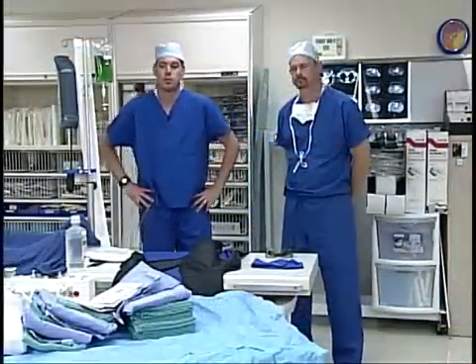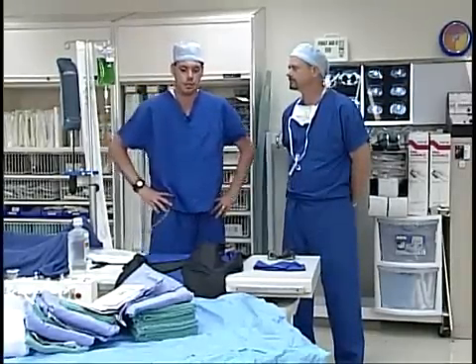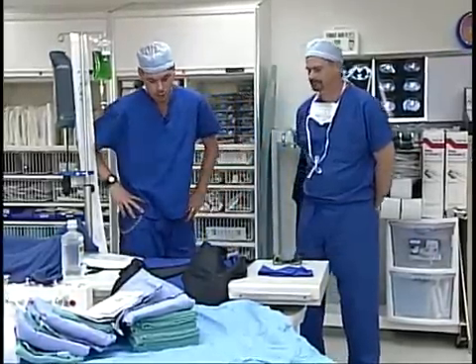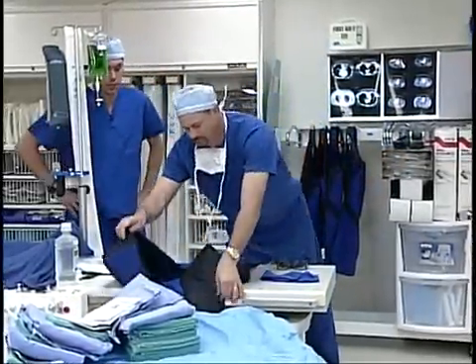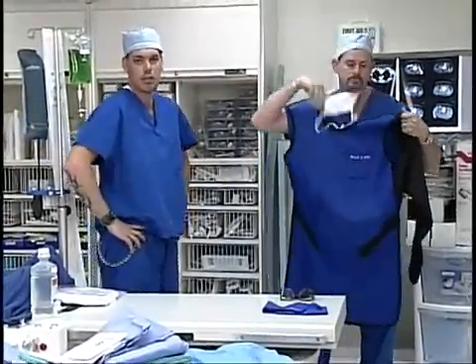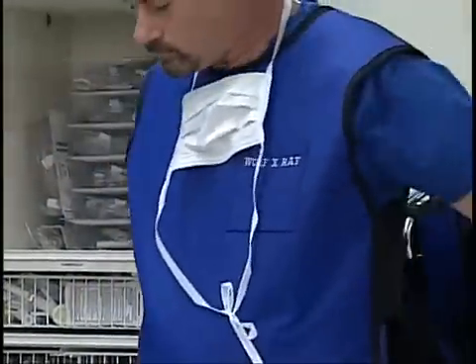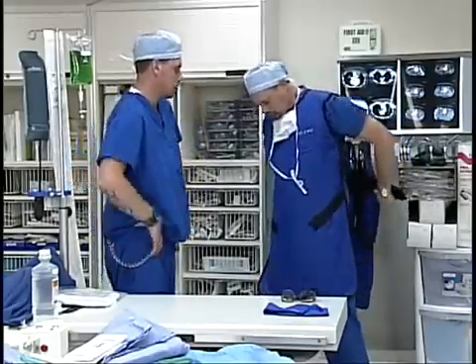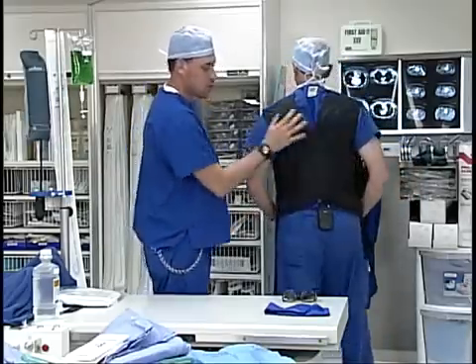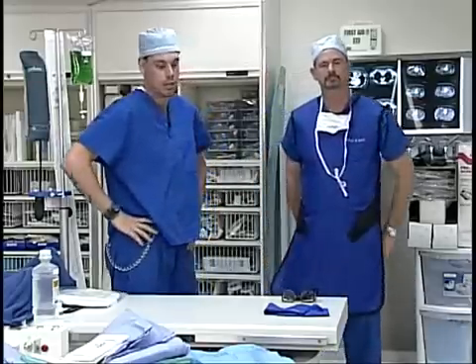Now that we've dropped all of our equipment on the table and created a sterile field, we are ready to go and scrub our hands. The first thing we need to do before we scrub is put on all of our personal protective equipment. The first thing Scott's going to put on is this lead apron. This apron provides a protective barrier between yourself and the x-rays that you're going to be exposed to in the lab. On this particular lead there's a lead barrier in the front, but if Scott turns around there's no protection in the back, so you're going to want to make sure you keep this lead barrier between yourself and the x-ray tube at all times.